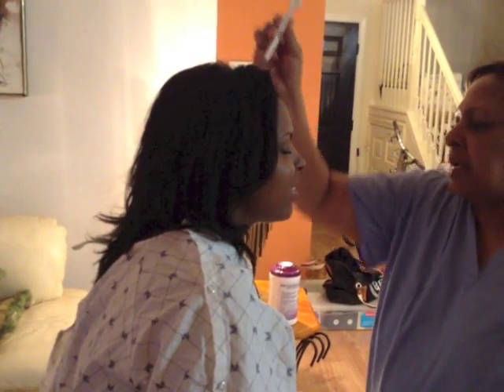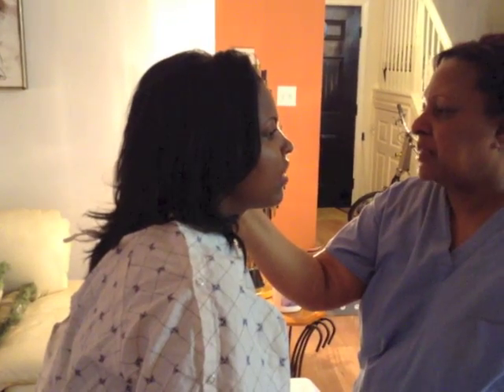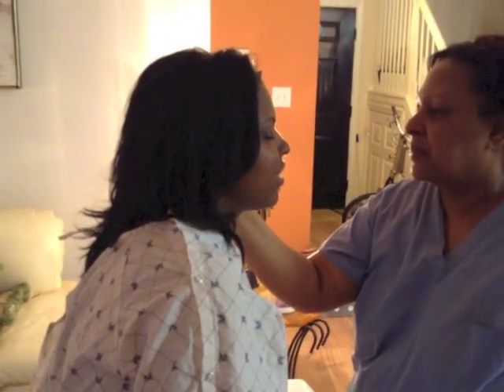Yeah. Okay, now I'm going to put the tuning fork on the mastoid part of your ear. Tell me when you can stop hearing it. Can you hear it? Tell me when it stopped. Yes, I hear it. Tell me when it stopped. Okay. Okay, I'm going to put it in front of your ear, and you tell me when it stopped.